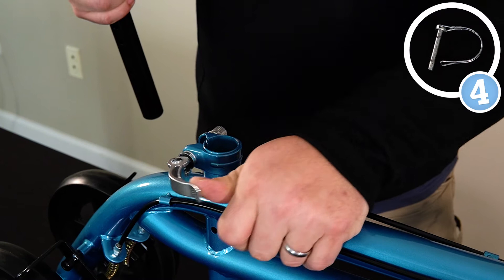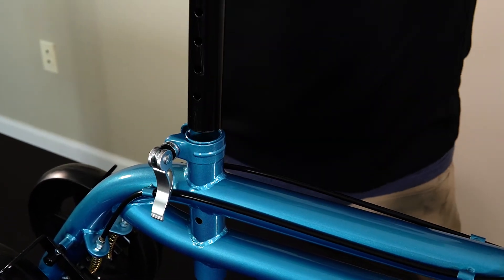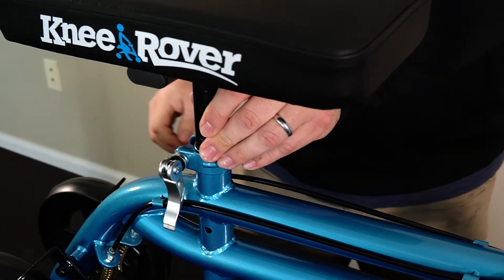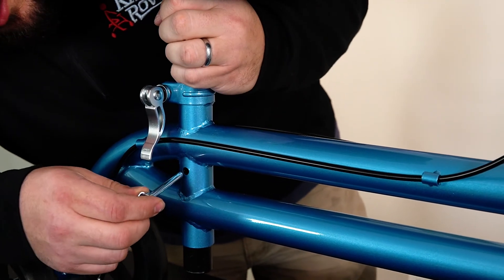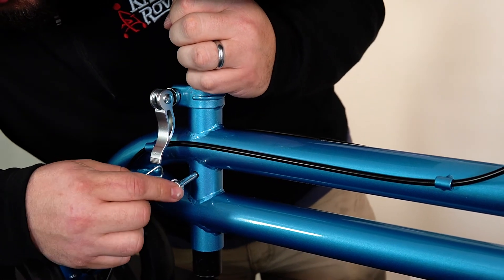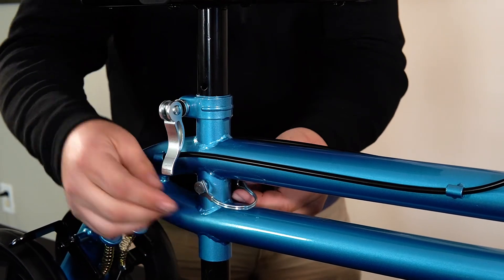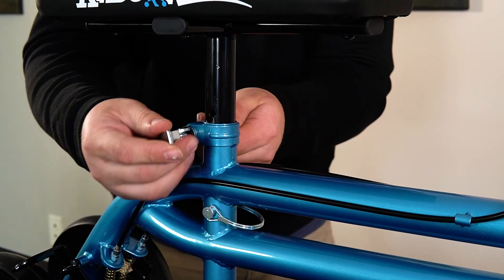Step number four, we're going to open this quick release lever up here. You're going to drop the knee pad platform into the hole. Take this locking pin, line it up with the hole, go all the way through, and then secure it on the other side. Then take this lever and clamp it around.